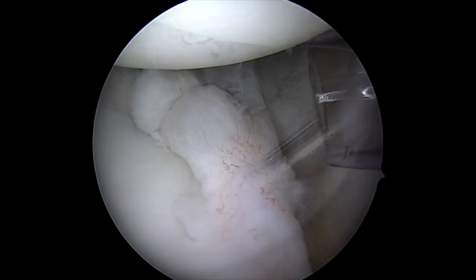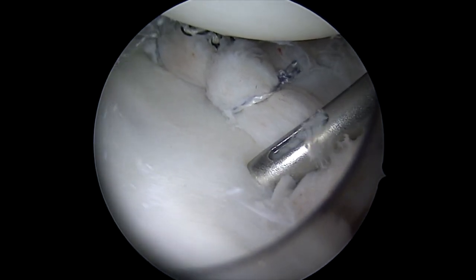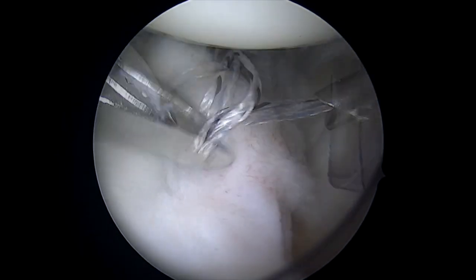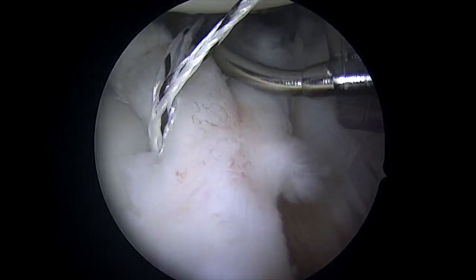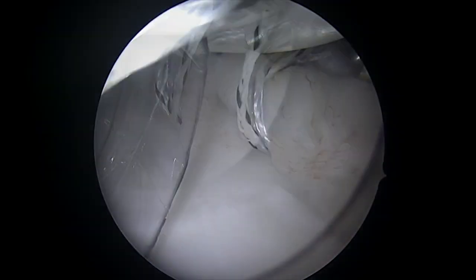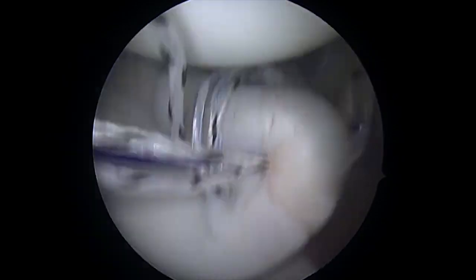Here's placement for one more anchor, and you can see what a nice bumper we've created so far. We're going to continue that all the way up the face. We'll bring our spectrum suture passer here from the front, pass through the capsule, and translate that tissue up on the face.